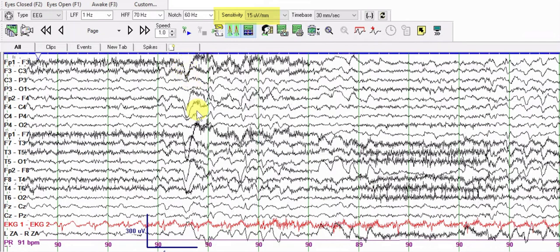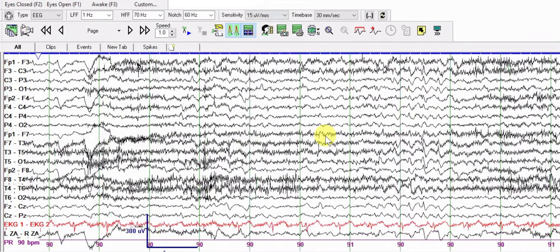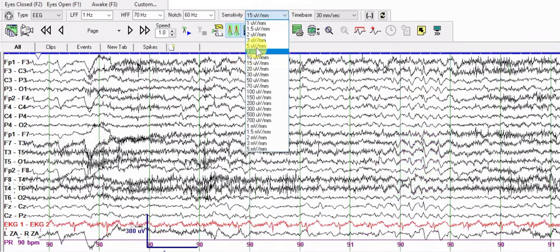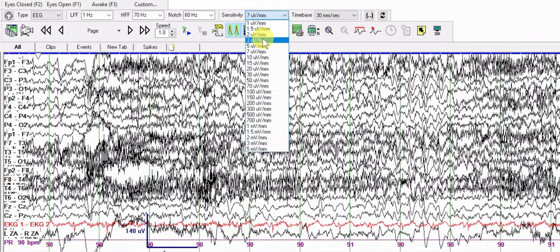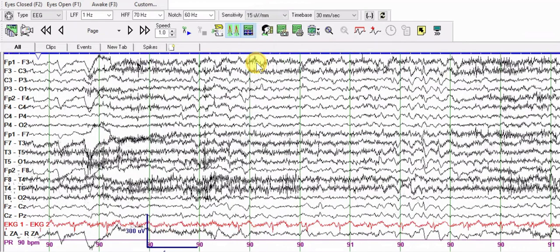These are eye blink artifacts. We do not see a posterior dominant alpha rhythm on the EEG. Moving to the next page, we can see a lot of muscle artifacts — this fast activity is the muscle artifact. We are seeing a lot of slowing in the background, and there are some sharp components. Going from 15 back to 7 microvolts per millimeter, those sharp components and the slowing become much more prominent. For reviewing purposes, let's go back to 15 microvolts per millimeter.